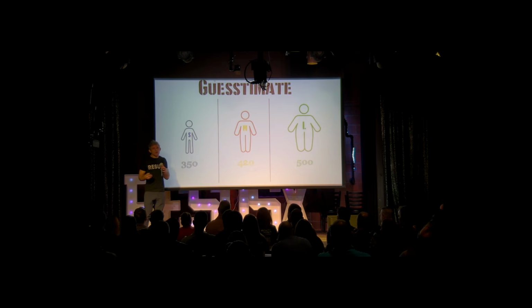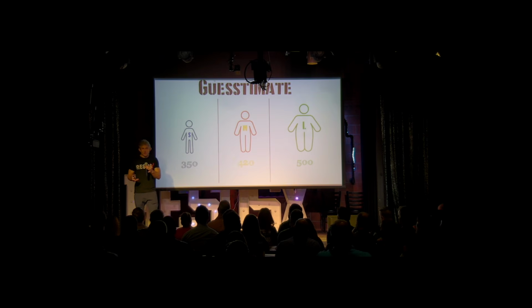And that's because lung volumes aren't purely based on the anatomical size of the patient, right? It's based on the disease that they have as well, right? So as people get sicker, the lung volumes that are participating in ventilation get smaller and smaller. So guesstimation is probably just as good as measuring with a tape measure. The trick is you have to check your work afterwards.